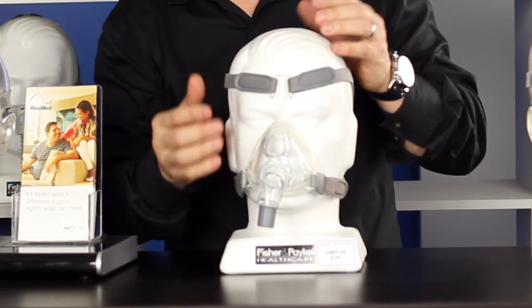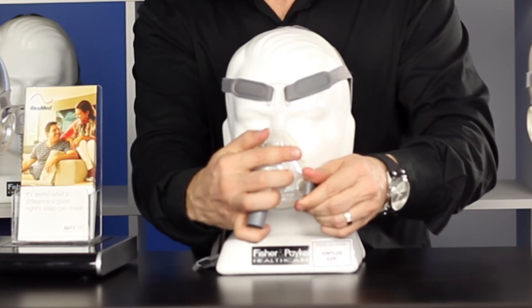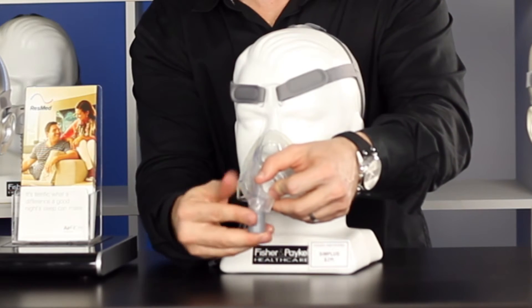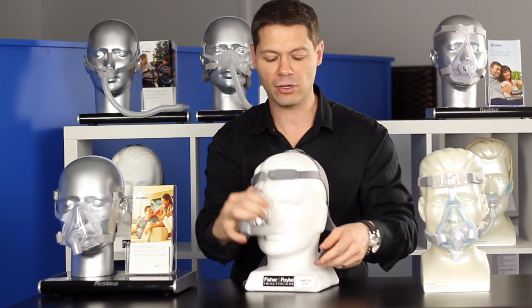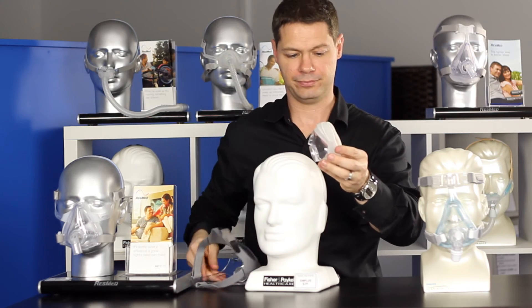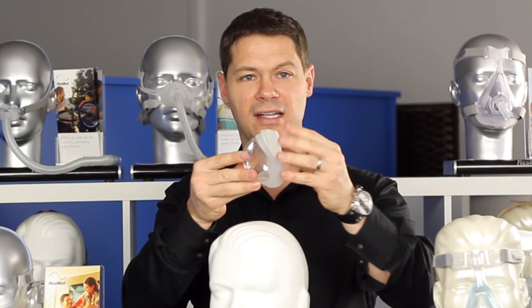Having said that, there's adjustability on the top of the head with this, as well as a quick release valve for going to the bathroom, so that stays in your tube. One of the things we like about the Simplus mask is that the cushion has a lot of elasticity in it, so it's very soft on the face.